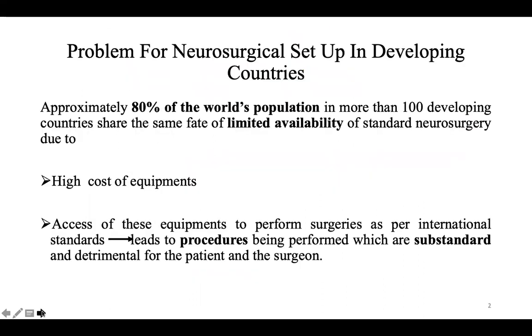Firstly, I would like to emphasize the problem of setting up a neurosurgical setup in a developing country. Approximately 80% of the world's population in more than 100 developing countries share the same fate of limited availability of neurosurgery due to high cost of equipment and access of these equipments to perform surgery as per international standards.